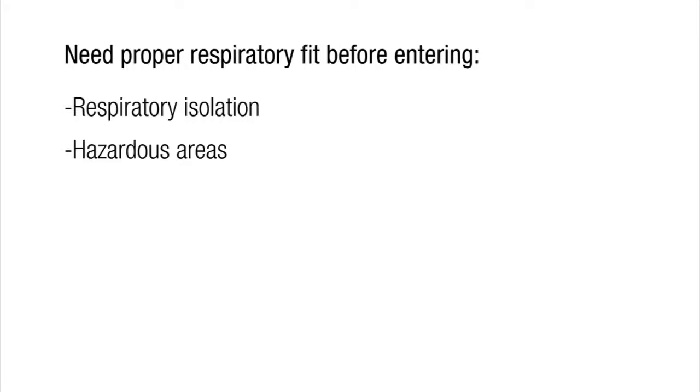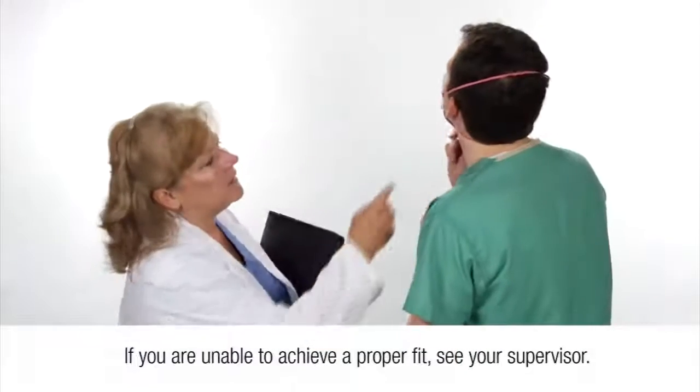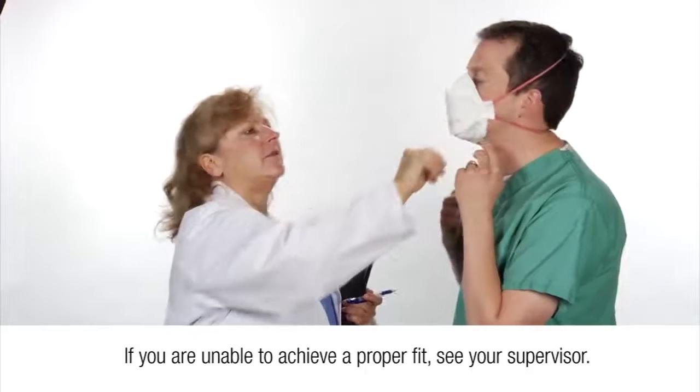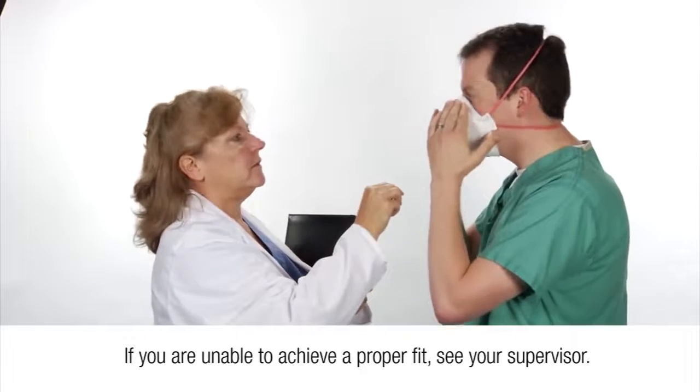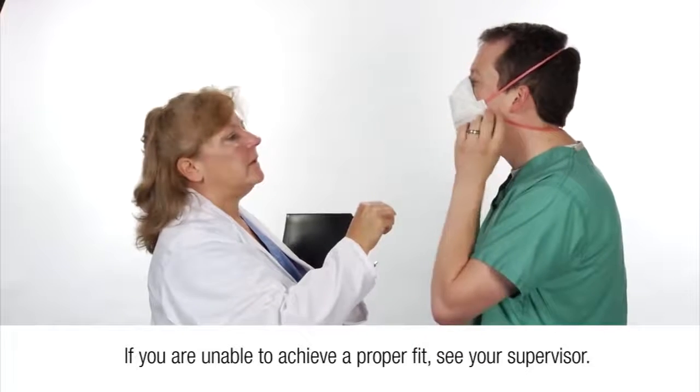If you have difficulty achieving a fit, review the respirator user instructions located inside the packaging or refer to the instructions on the 3M 1870 Wear It Right poster to ensure that you are following the correct procedure. If you are still unable to achieve a fit, see your supervisor or a representative from your infection control or employee health and safety departments. Do not enter a hazardous or infectious area.